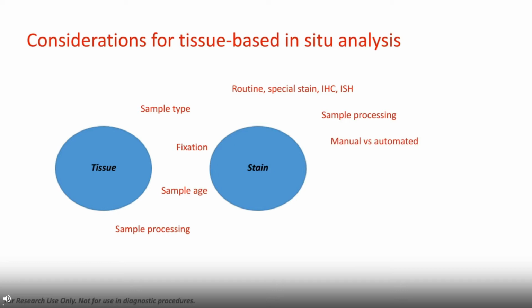And if we are using a system, are we going to use commercial reagents, so they're more standardized, we can buy them in bulk, or are we going to develop them in-house to use in these processes, which can have a lot more variation in the stain that's produced in a large sample size.